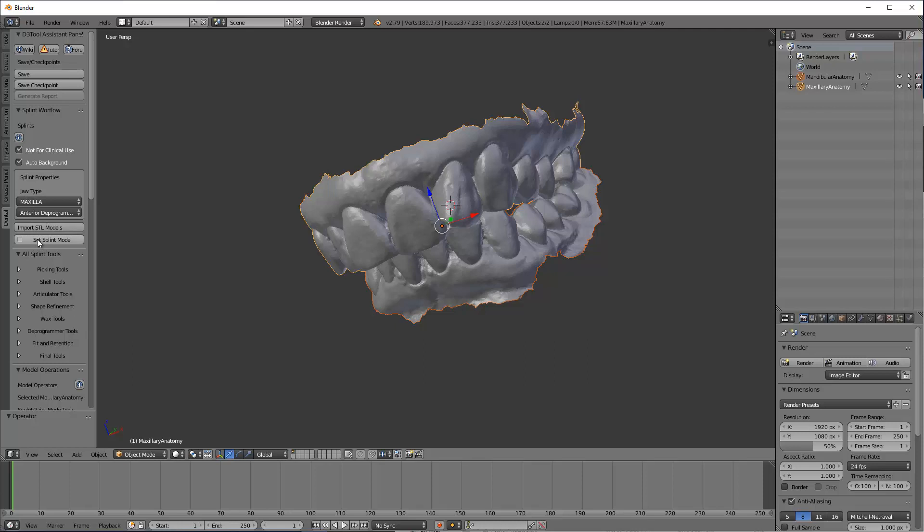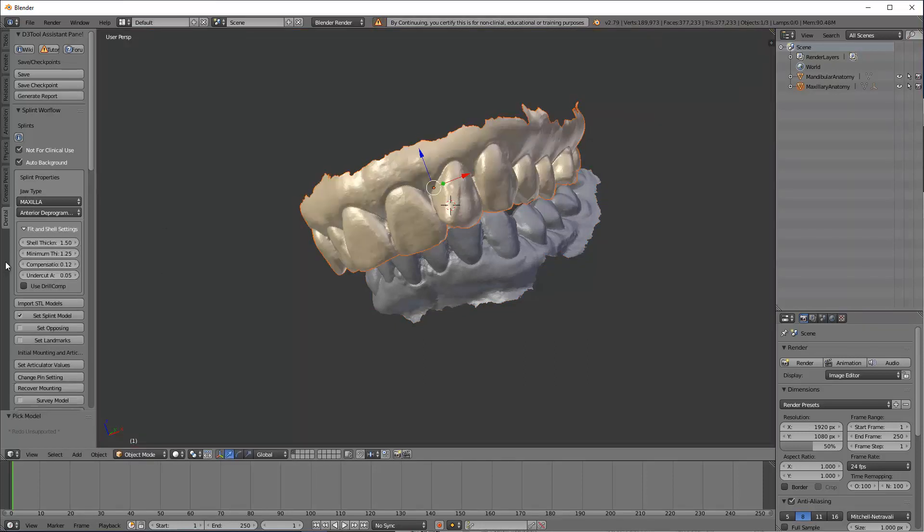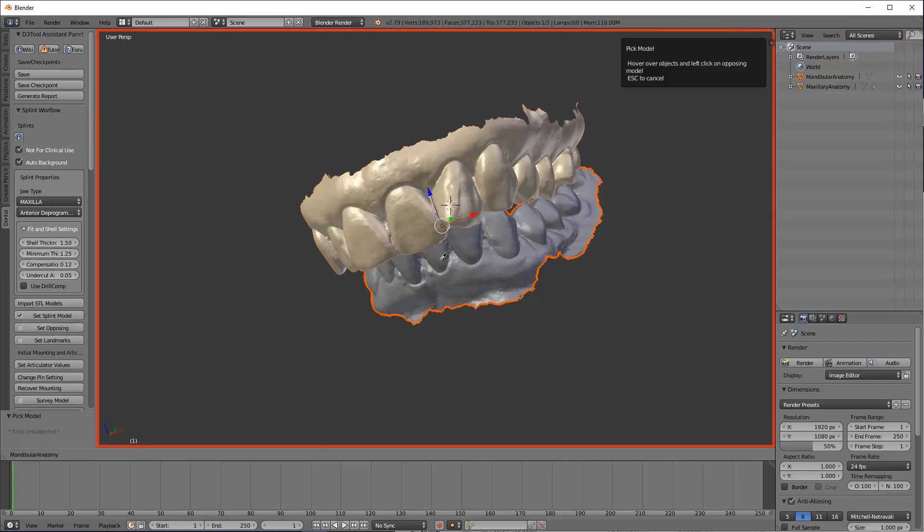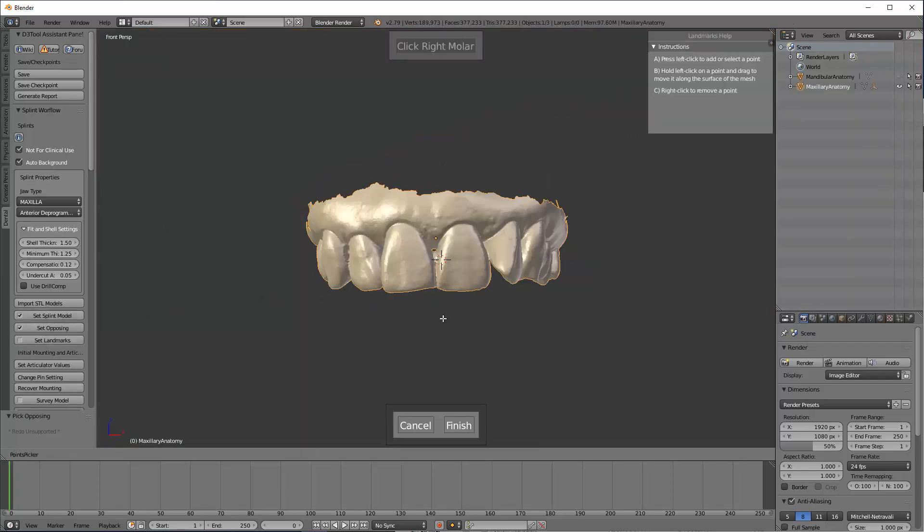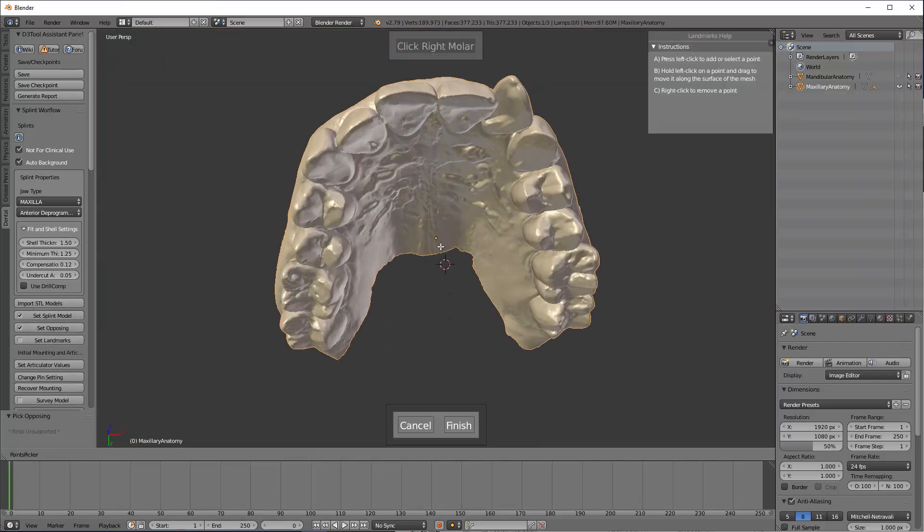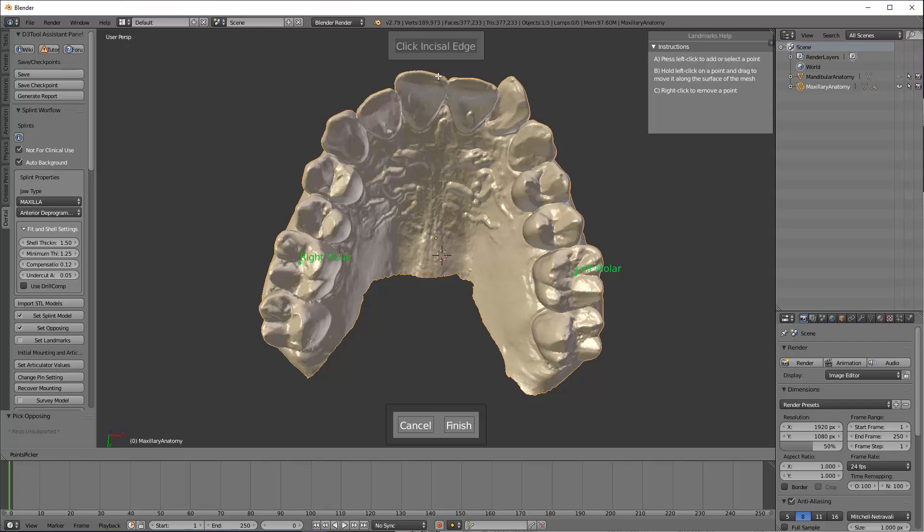First thing to do is hit set the splint model, click on that. Now click on here, set the opposing, click on here. Set the landmarks. This is telling you what's front, what's back, what's up, what's down, right molar, left molar, incisal edge, and midline. Okay. Now you can go ahead and hit finish.